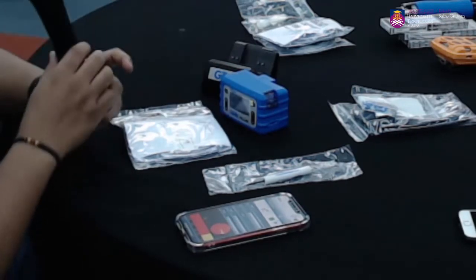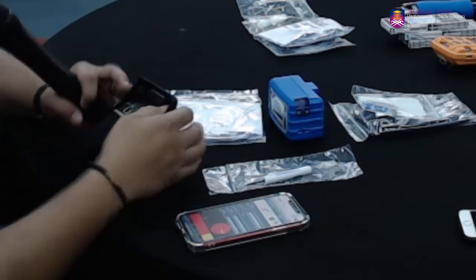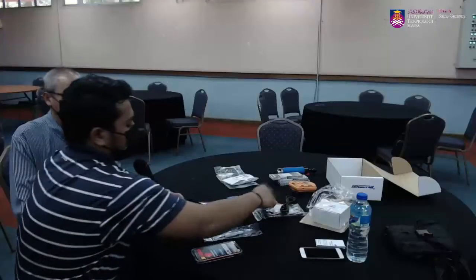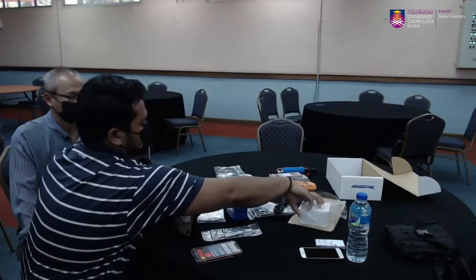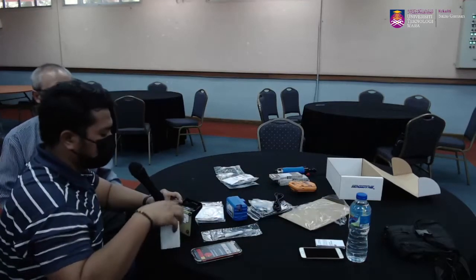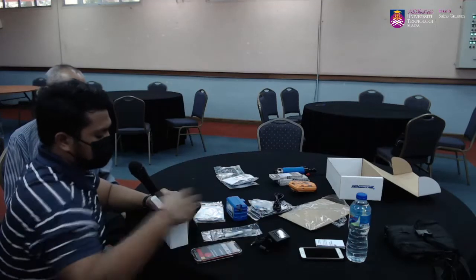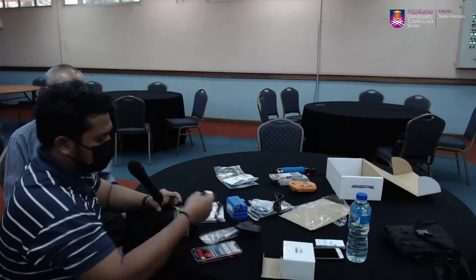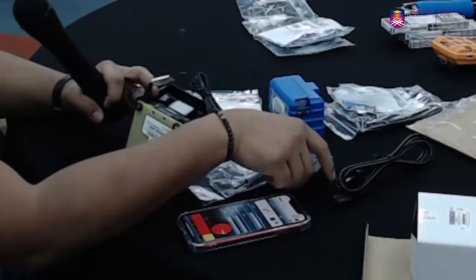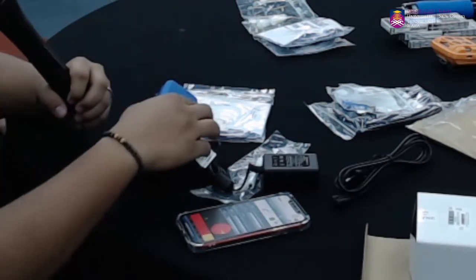And then also in terms of kalau nak charging, kita just put it, kita pasangkan AC connector bahagian belakang ni, with the supply cable. And then kita just connect kat sini. And then kita connectkan this wire, plug it into the socket, and then kita just plug it in like this.